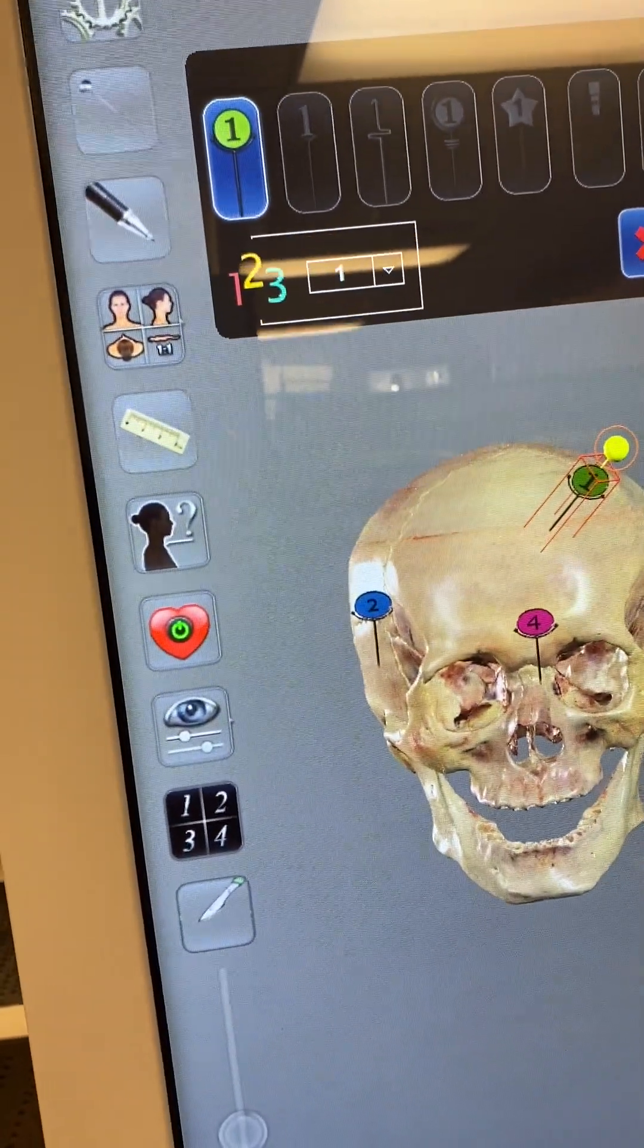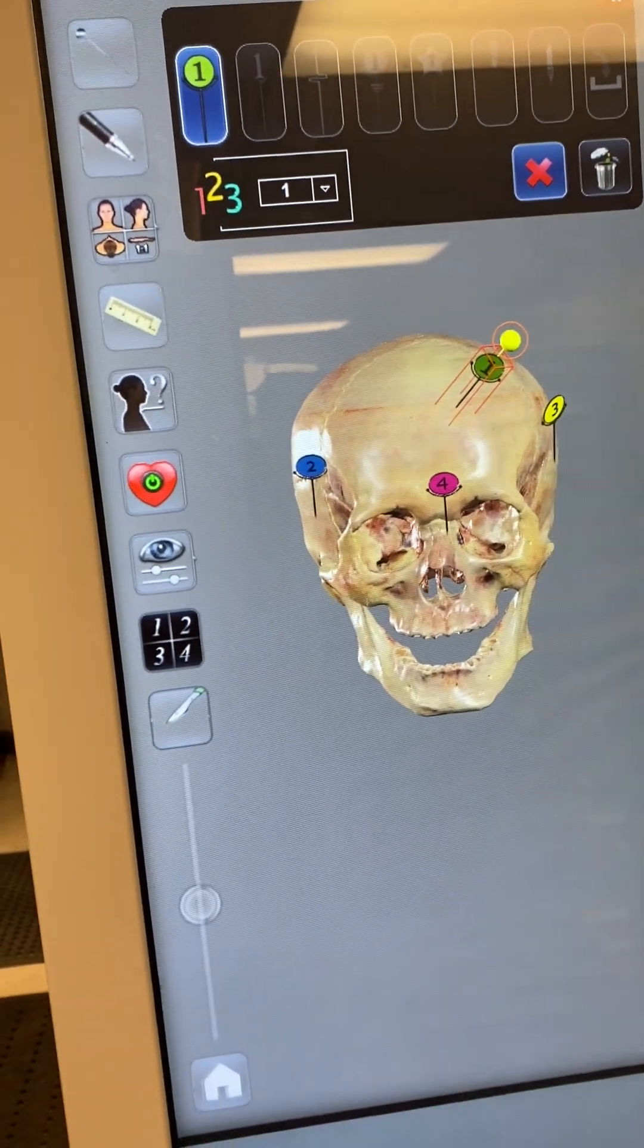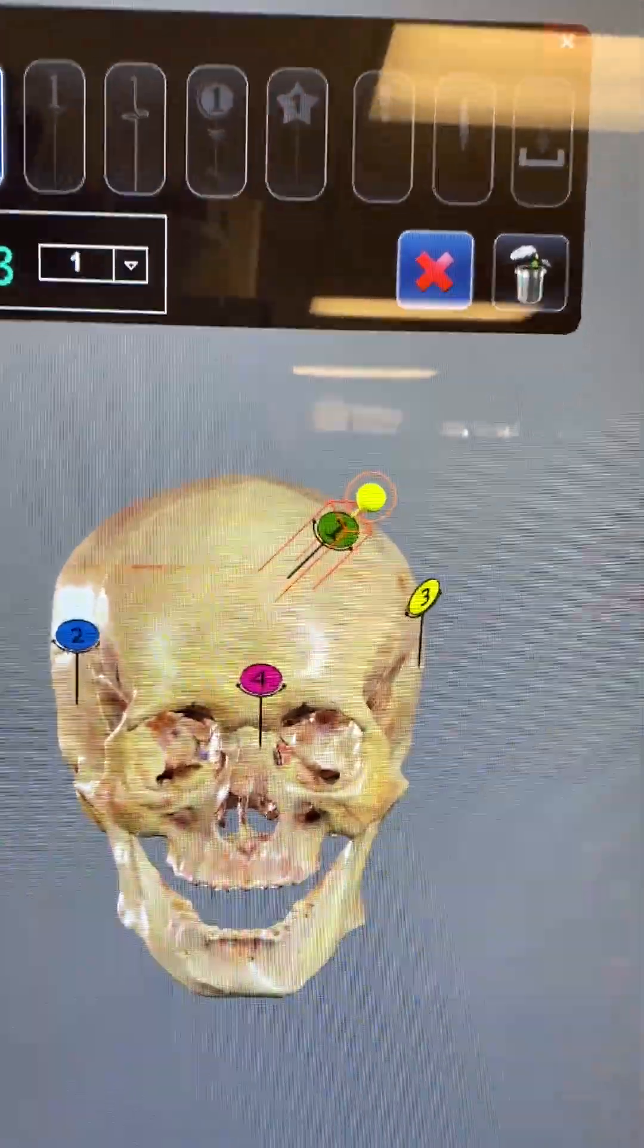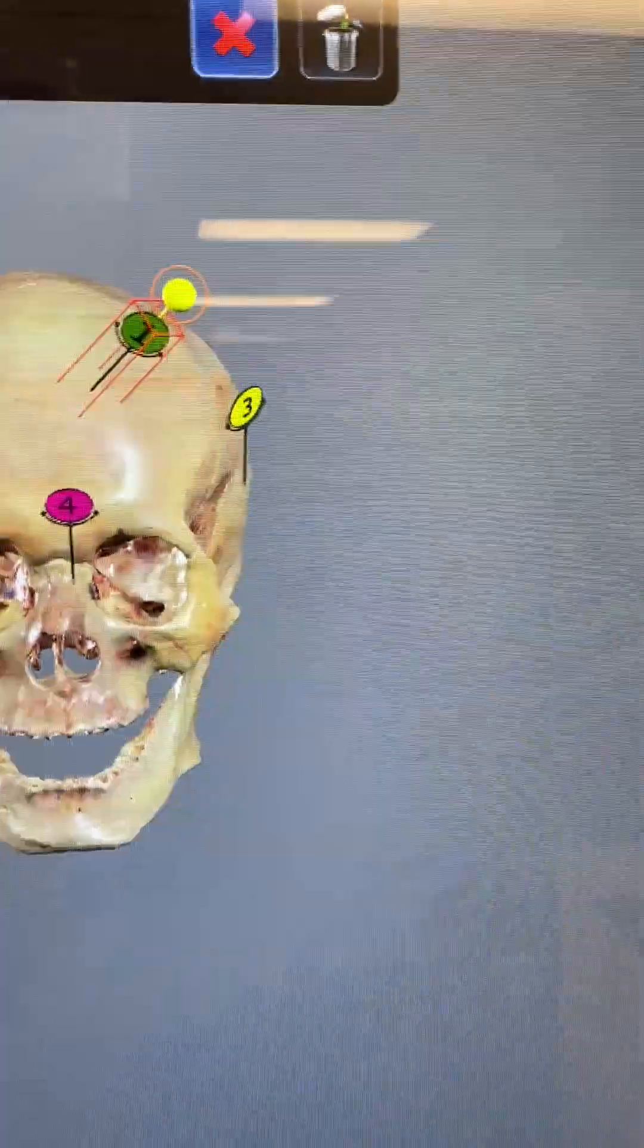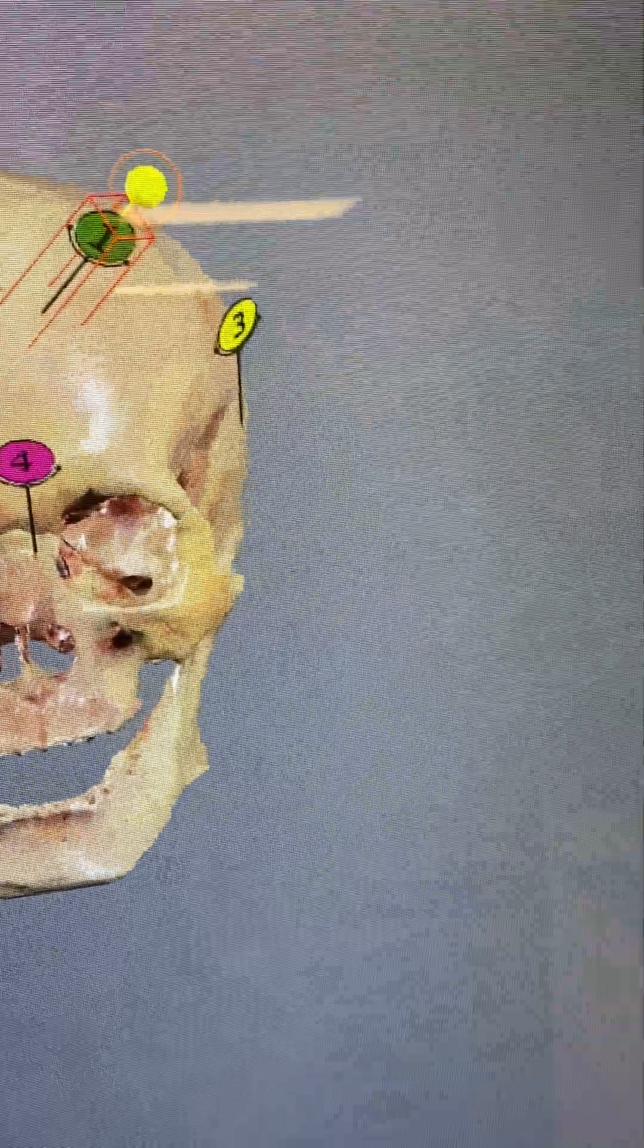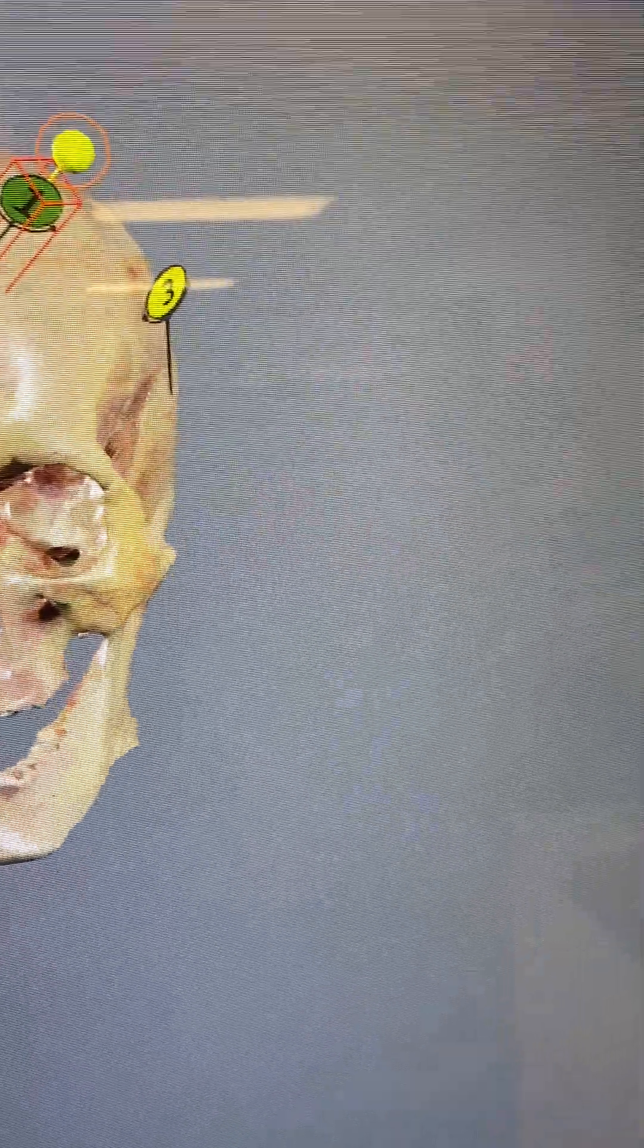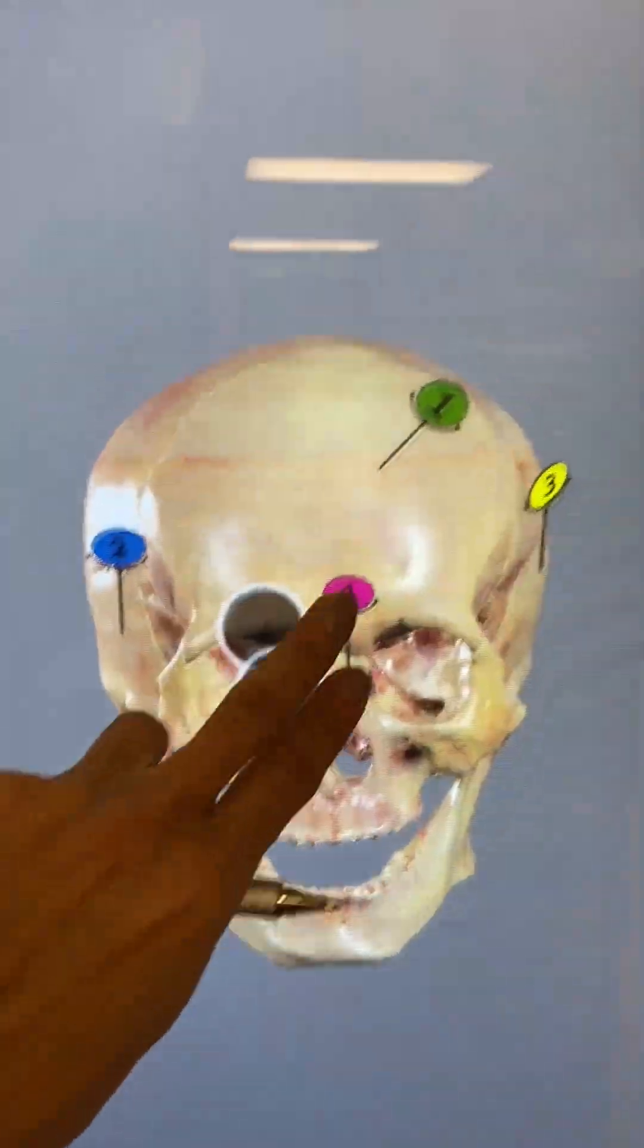When this menu is open, you can manipulate these pins. You can move them around, change the numbers, do whatever you want. Once you close this menu, you can see that all these are going to be locked. If I move these, the pins are not moving.